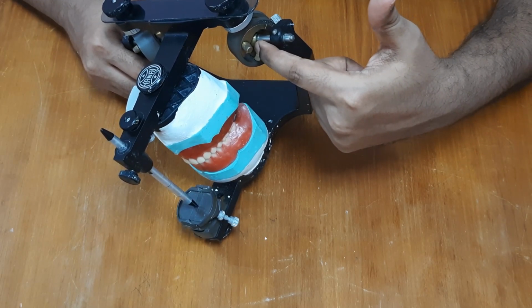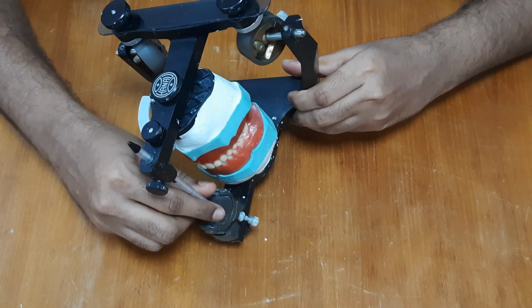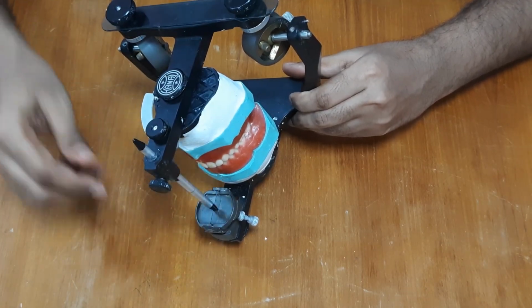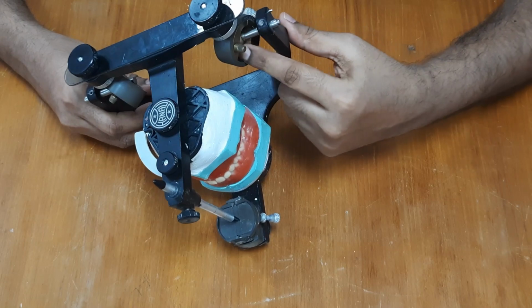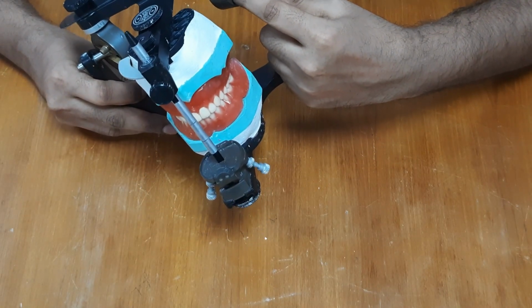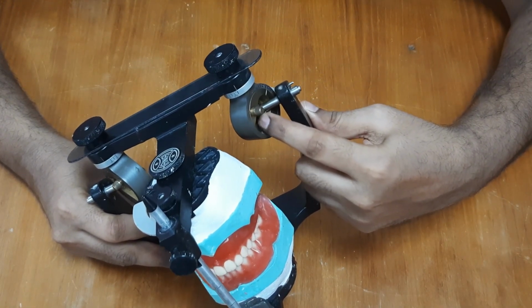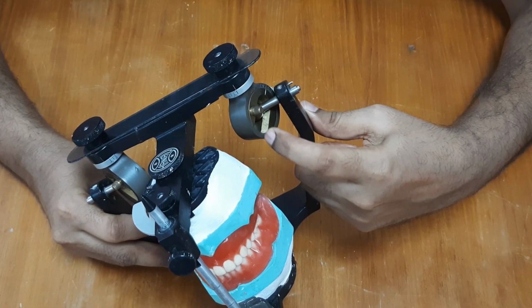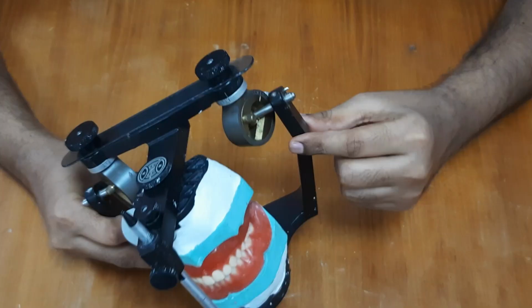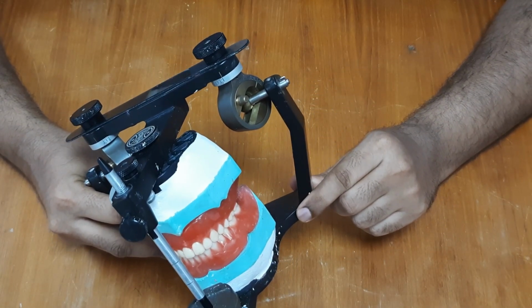The condylar shaft is a cylindrical piece of metal and can freely rotate. At the end of this shaft is a ball. This is a metal ball. It is called a condylar element. It represents the condyle of the mandible. The condyle of the mandible here is attached to the lower member. So it is described as an Arcon articulator.